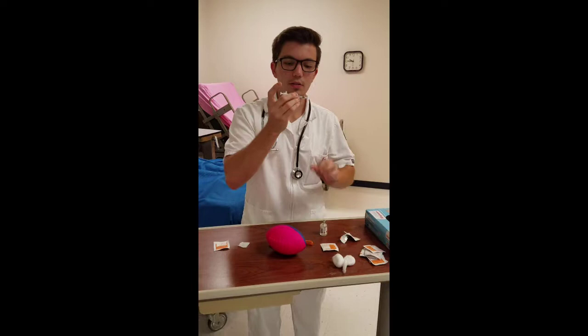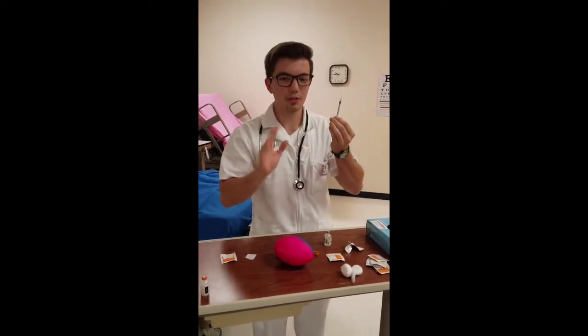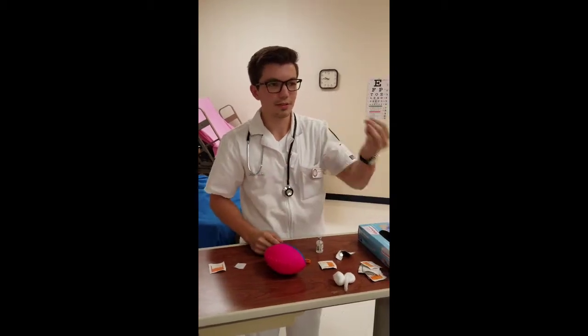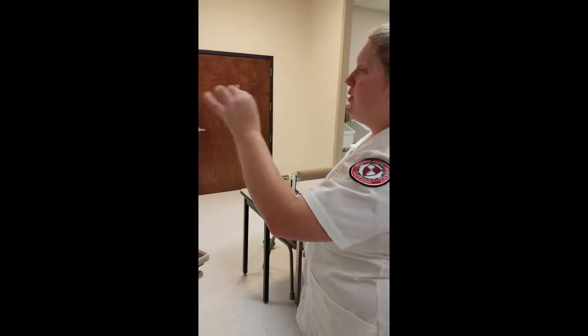Before you administer, you're going to want to check your insulin with another nurse. You're not going to want to tell them how much you're drawing up so they can tell for themselves. 2 units. Alright.